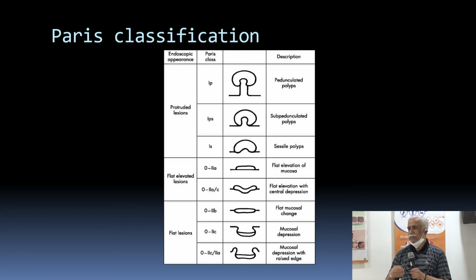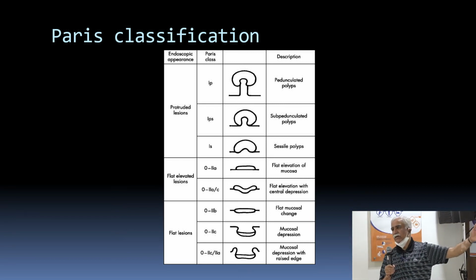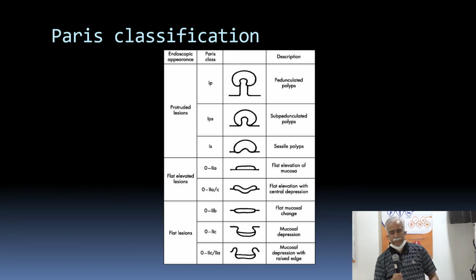Say for example, you say, I see a solitary lesion in the antrum, which appears a little red, indistinct borders, 0-IIa, measuring about 4 millimeters at the incisura, on the curve or whatever it is. Right? So all that should come in. Next slide.